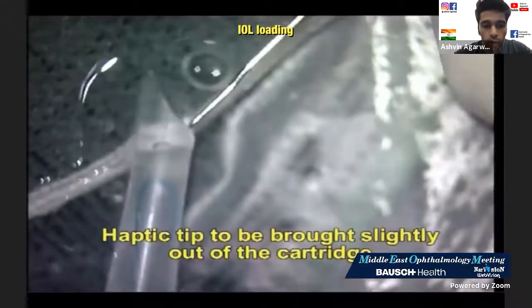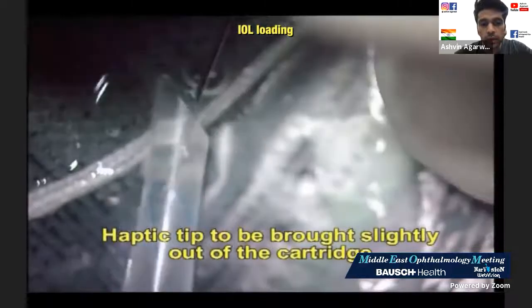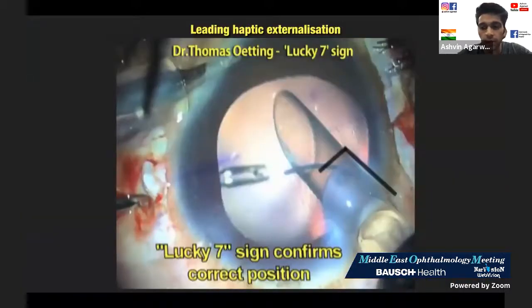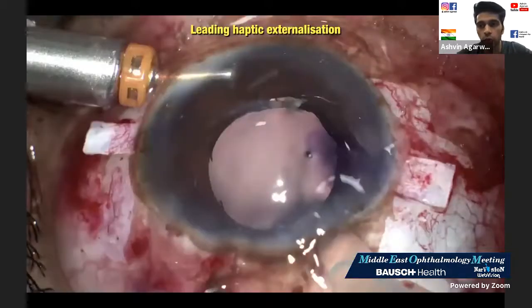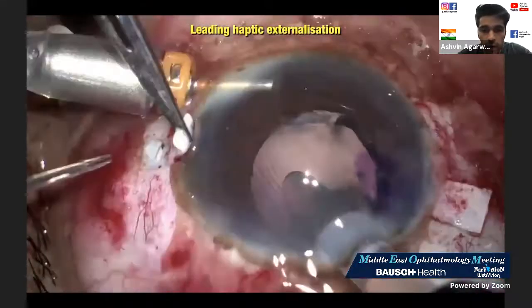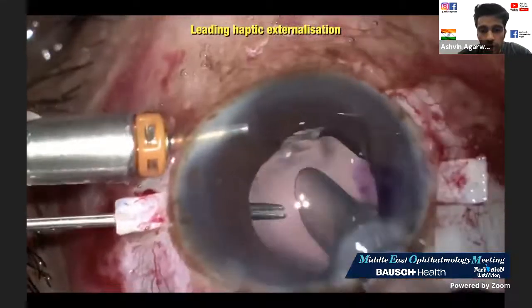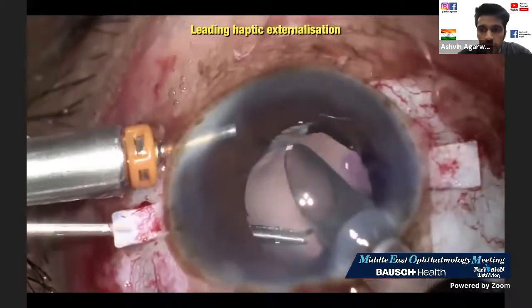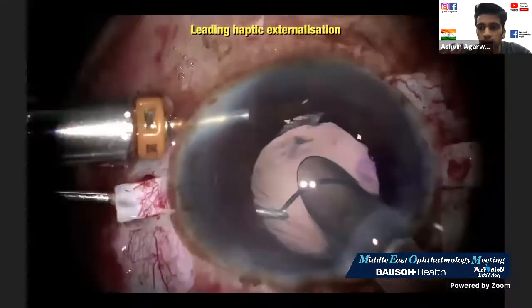Because what you want to do is basically bring it or externalize a little bit of it and keep it open. The reason I do this is you want this lucky 7 sign. The reason I want a lucky 7 sign is I don't want a springing action of the intraocular lens springing into the eye, because I don't have a bag here. So once I have inserted the injector in, I have my glued intraocular lens forceps. Now all I need to do is just eject a little bit of that intraocular lens and I can grab it. Now I'm safe.